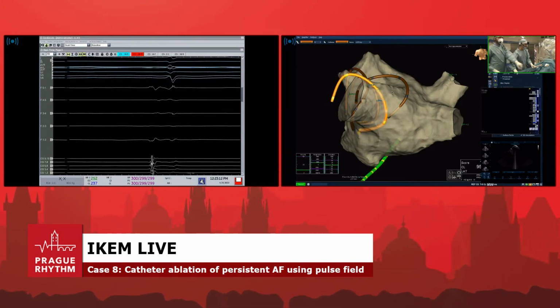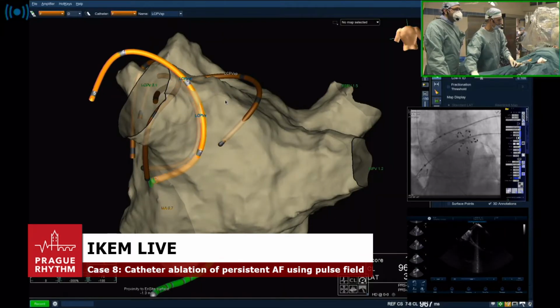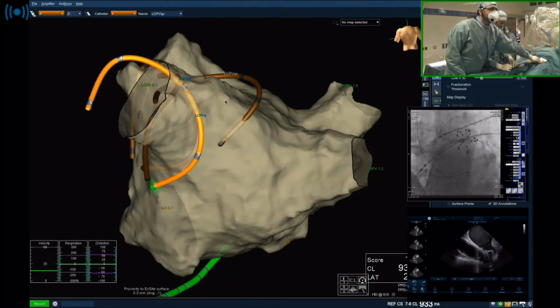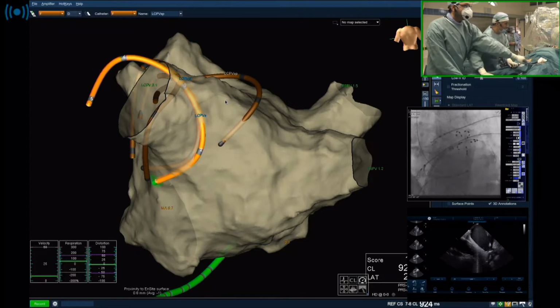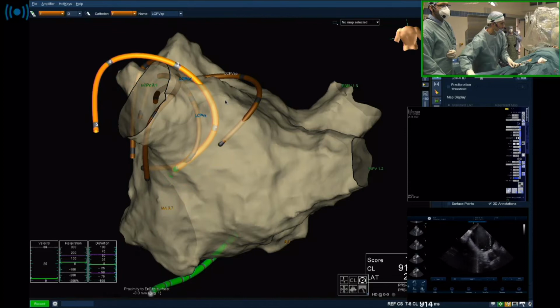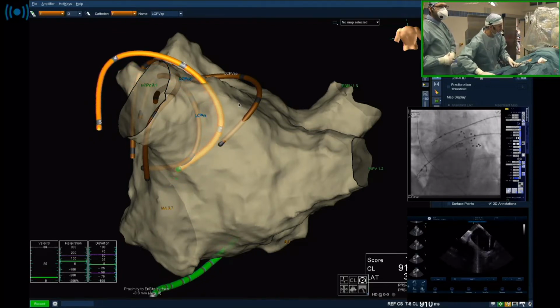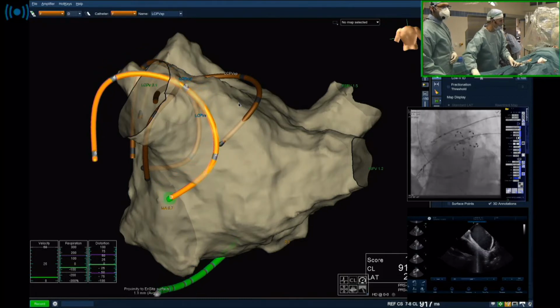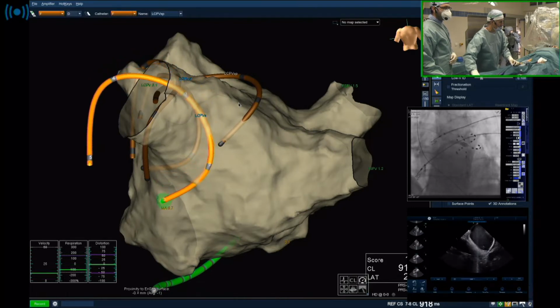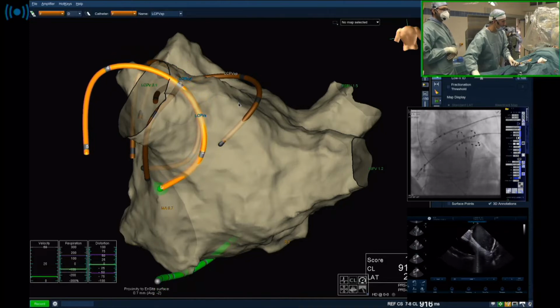Okay, so now we come back. Sorry, Predrag. Let me try and cannulate the inferior branch. Okay, come here. Yeah. You like this, Predrag? Yeah. Okay, but I come back. You want to make a basket? Yeah, that's it. You're right. Keep the wire inside. Let me go in a flower again. We have to go deep in that. Let me just cannulate the most inferior branch. We succeeded. Yeah, I like this.